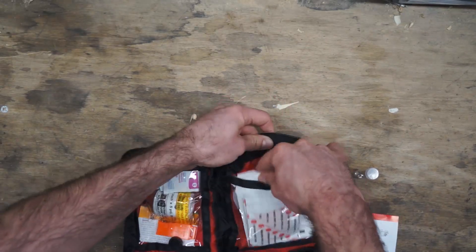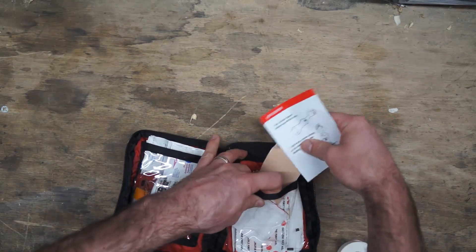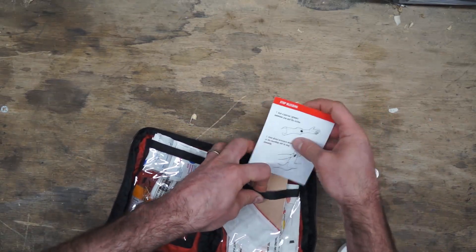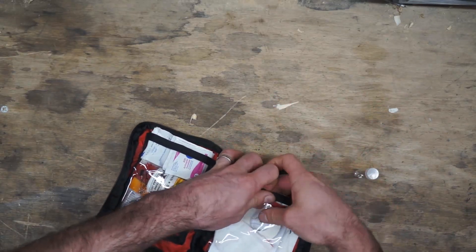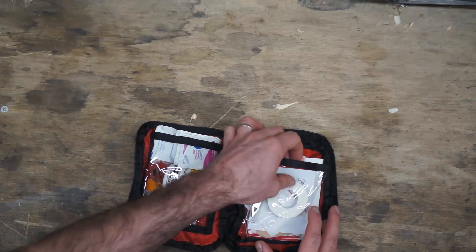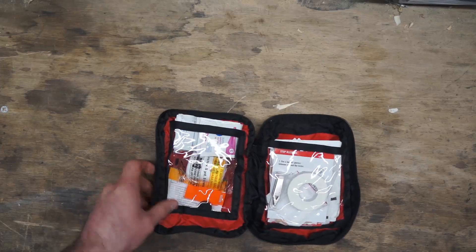It's not going to be anything overly comprehensive, but if you have a headache or a small cut, scrape, or bruise, it's going to help make the day a little better. It's also not one of those kits that once you take it all out you can never get it to fit back in. Moving over to the left-hand side.